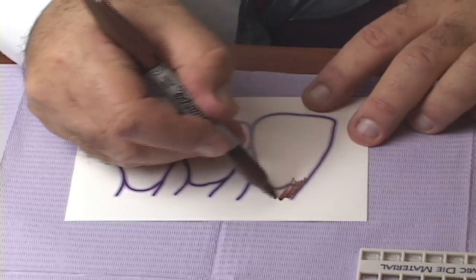The first thing we need to do is take a look at the neck color of the tooth. In order to establish the neck or the root color of the tooth, you look at the CEJ area and find a shade guide that fits into that area and mark what part of the tooth it's covering.